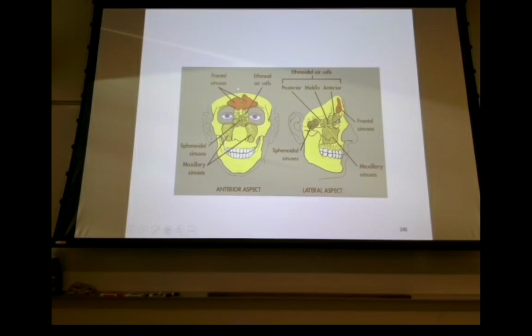So this is what we're looking at. So we have frontal sinuses here with the septum right around midline. You got sphenoid sinuses, you can't really see that here, but it's right dead square in the middle. You got the ethmoid sinuses on either side, and then you've got the maxillary sinuses. So if this time of the year, in East Texas, you got all that green stuff blowing around from the pine trees, and you're going to see a lot of people with sinus infections. They've probably seen the CT more than what you're going to see. But you can kind of diagnose where the sinus infection likely is based on where the patient's pain is.